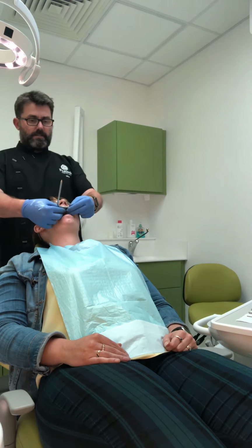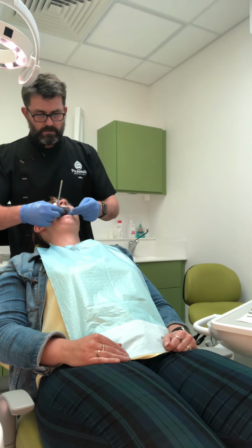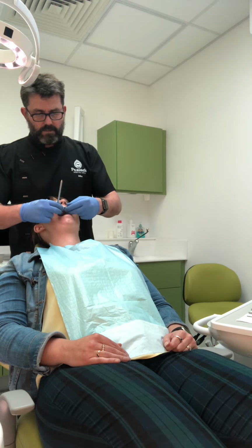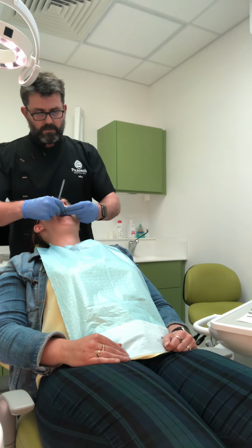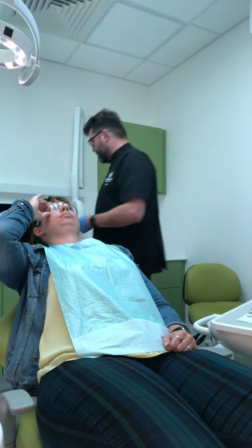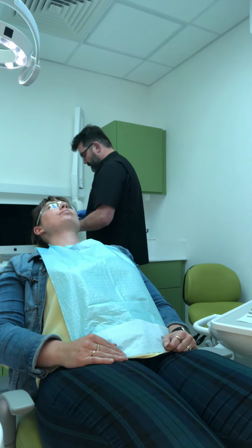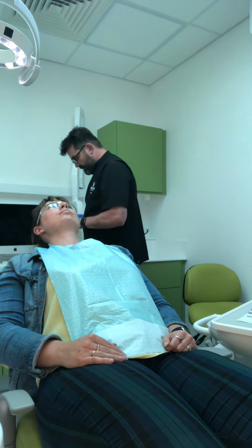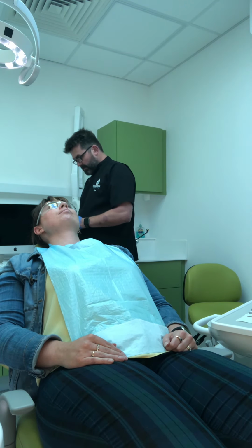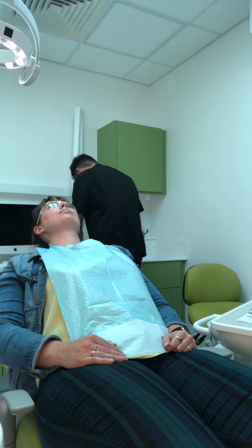Still a little bit rubbery. There is a bit of shift of the midline, isn't there? And there we go. So that'll come off nice and easily. I'm just going to trim any deep bits because I just want the cusp tips in that bite reg material, not the full buccal surfaces or anything like that. Should have got a scalpel to this. Good stuff.